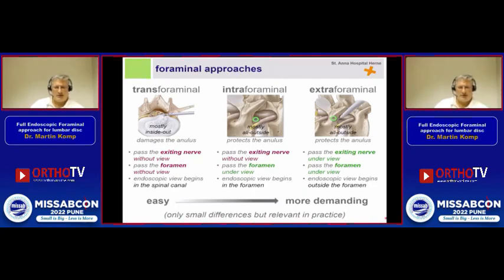So when we look at these foraminal approaches, trans, intra, and extra, you may say, oh, these are only small differences. That's right. But for us, they are really relevant for our daily practice. And it is quite easy to do a transforaminal approach because everything is fixed when you insert the endoscope, and it's much more demanding to do an intra or extraforaminal approach. So these are, especially these approaches for more experts after starting with a transforaminal approach.